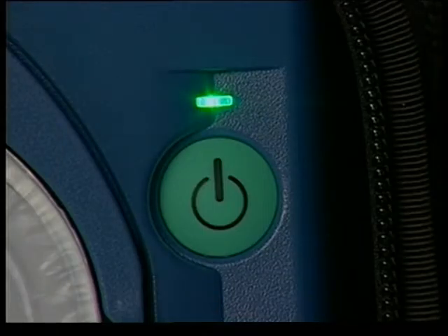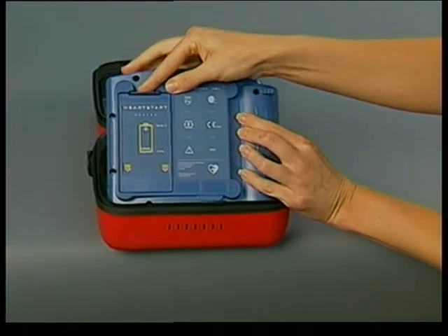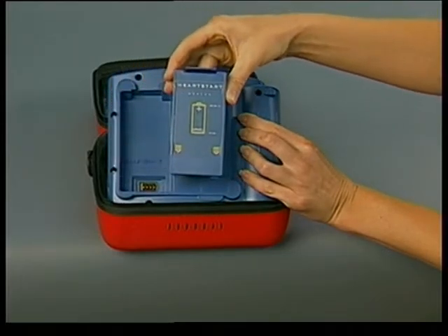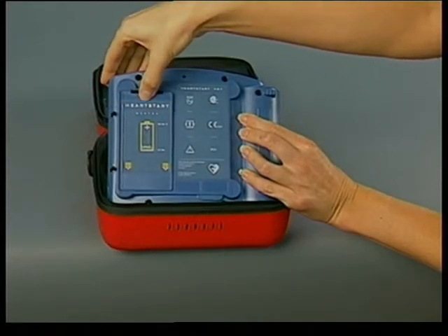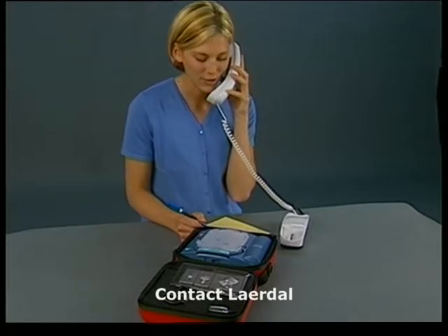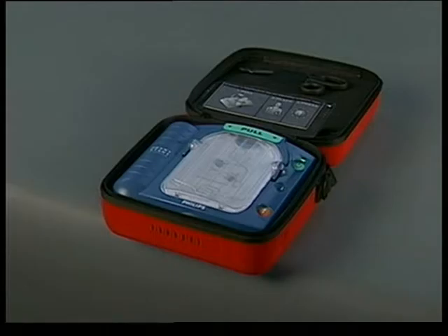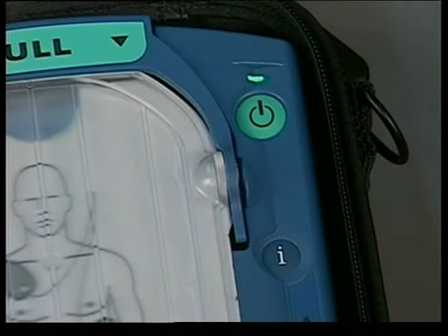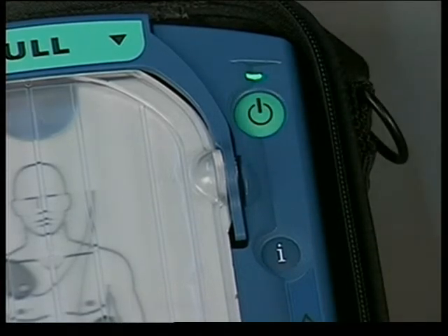The defibrillator reports the test results and then turns off. Check the ready light to be sure it is blinking. If the ready light is not blinking and the HeartStart is chirping, remove the battery for at least 5 seconds, then reinstall it and repeat the self-test. If a second self-test fails, contact Philips Medical Systems for service. In the unlikely event that the defibrillator is needed for use while you are running the self-test, simply press the green on-off button or pull the pad's cartridge handle to stop the test and turn on the device for use.